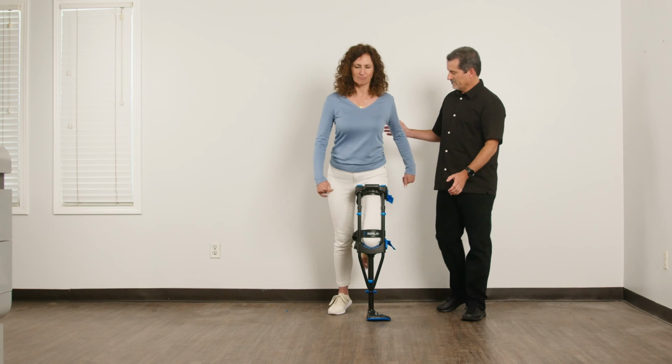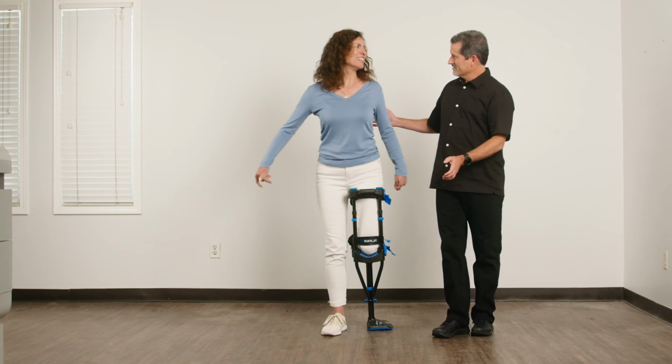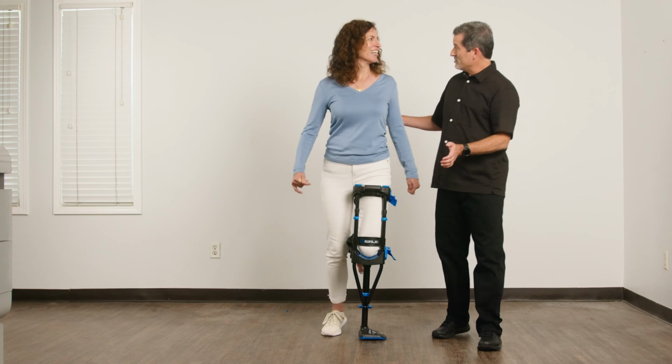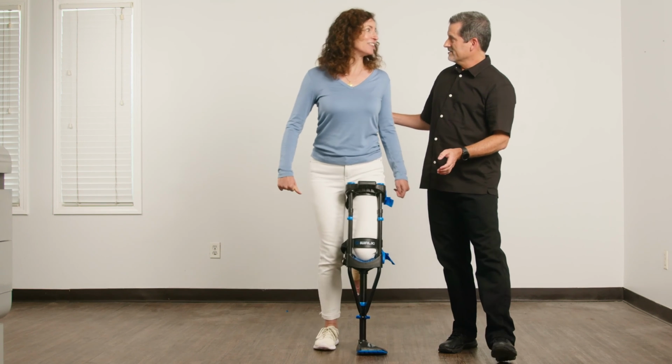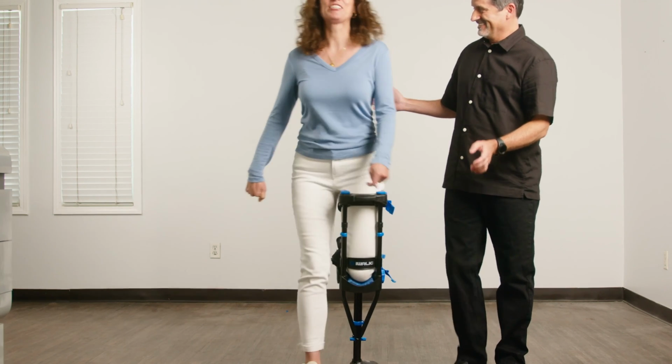While walking with them, engage them in conversation. Ask them about their job, family, hobbies, whatever, so that their mind is occupied in answering your questions, allowing their body to take over the job of adapting. This tactic can also work well for nervous or scared patients.